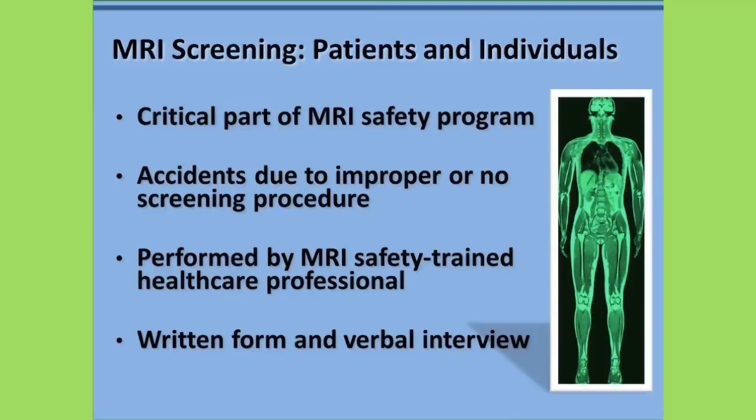Another important aspect of protecting patients and individuals from MRI-related injuries and accidents involves a complete understanding of the factors that may pose hazards for various implants and devices. Healthcare professionals who are specially trained in all aspects of MRI safety are responsible for screening patients and other individuals. These healthcare professionals should understand the potential hazards associated with the information contained on the screening forms and have inclusive knowledge of the relevant safety information.